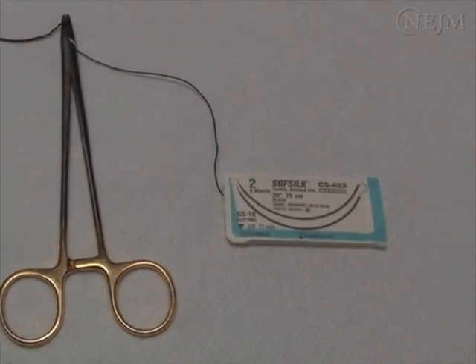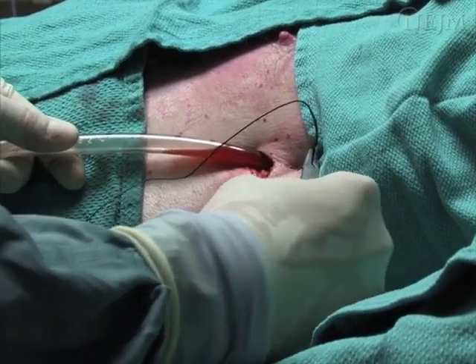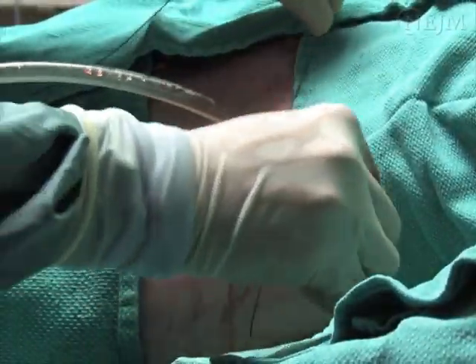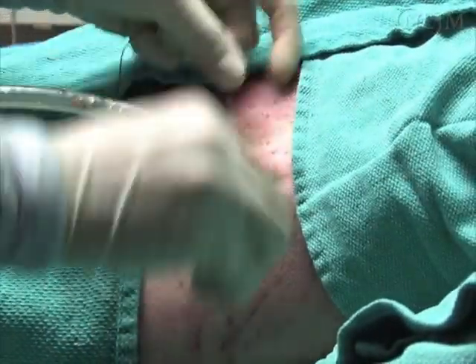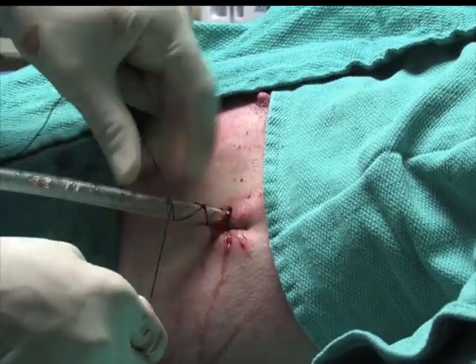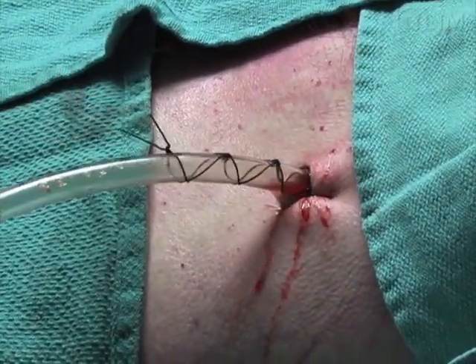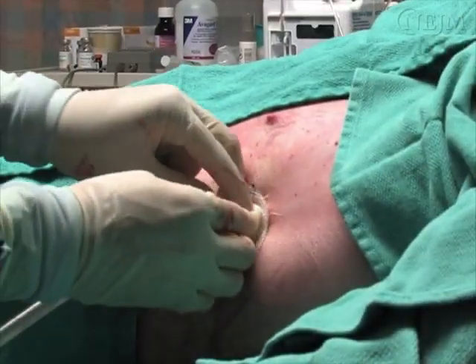Secure the chest tube to the skin using the heavy sutures. Simple interrupted or mattress sutures are often satisfactory to ensure stability of the tube and avoidance of air leaks around the tube. The free ends of the sutures are wrapped around the tube and tied multiple times to secure it in place. Purse string sutures are not recommended as they yield poor cosmetic results and increase the risk of skin necrosis. Once the chest tube has been secured, a petroleum-based gauze dressing should be wrapped around it.